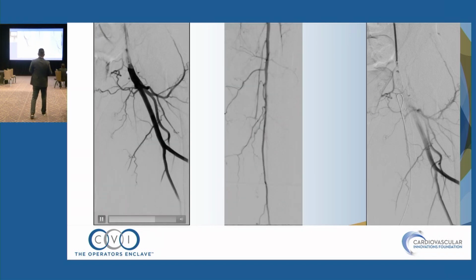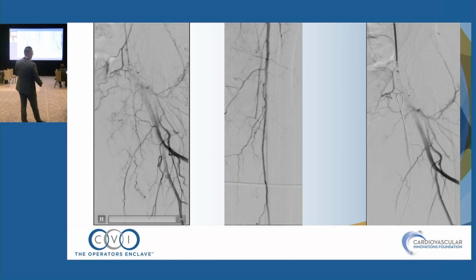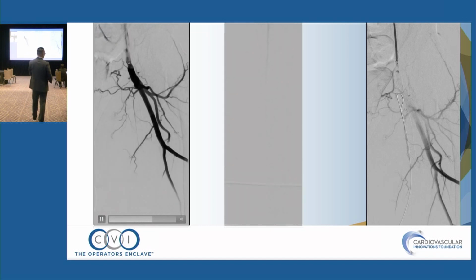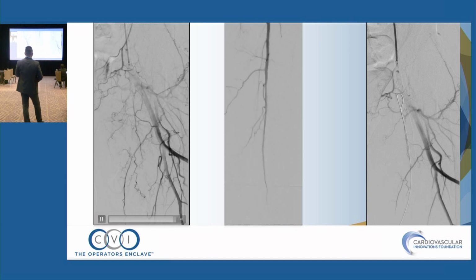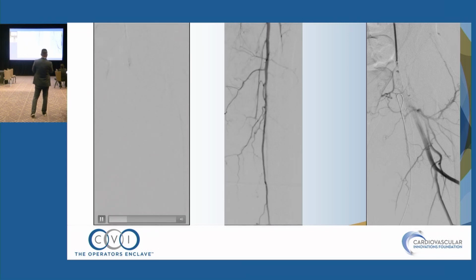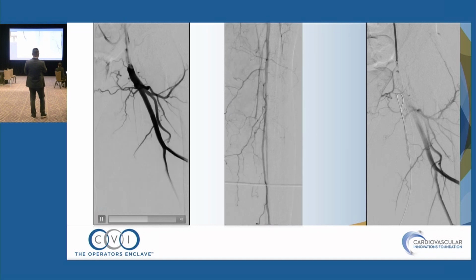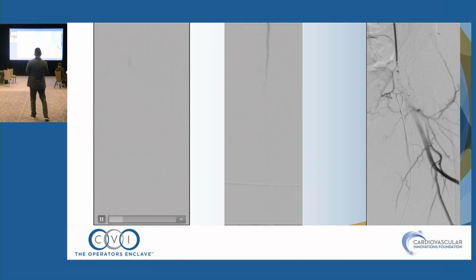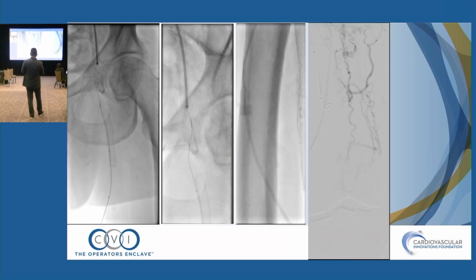So what I ended up doing here was I basically accessed the proximal SFA, so you can do distal SFA, but that's exactly where the stent fracture was. So I didn't really necessarily want to be in that stent fracture. I was thinking about excluding it or going around it, basically. So what I did here in the third frame is I get access here in the proximal thigh, which is pretty easy. It's still pretty superficial. The prep is a lot easier because you just basically extend the prep down here, cut the drape a little bit, and then my wire went here, but it kept hitting. I couldn't get through the stent, so it took a subintimal approach around the stent, so I just kept it there.